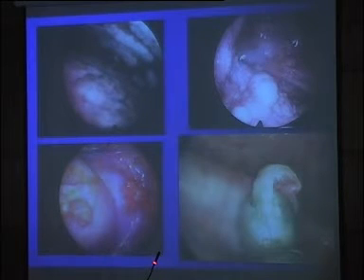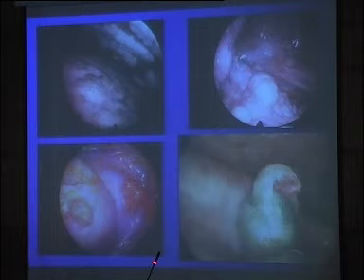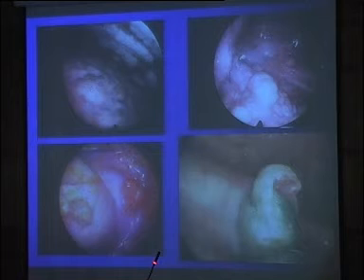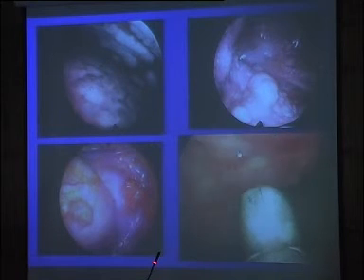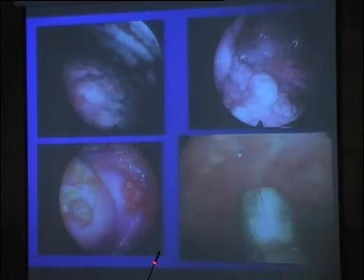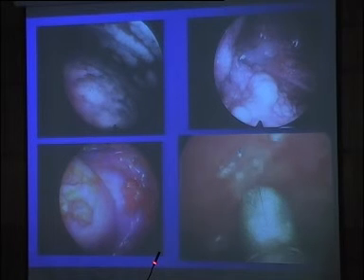Actually, usually in case of advanced disease, as in this case, the pleura is very thick. You know, it's difficult. But when you have few nodules in the pleural cavity, it's an important question also, the location of your biopsy. If you have the choice, try to sample on the rib because you avoid the intercostal vessel. Okay? Of course, if you have a nodule in the intercostal space, you grasp very carefully. Using the peeling biopsy, you can see what's happening beyond the tip of your forceps. And then if there is a vessel, you stop. You understand? Just under visual control. Okay?